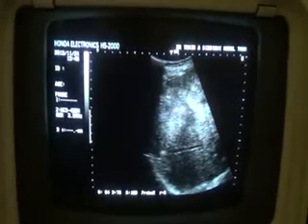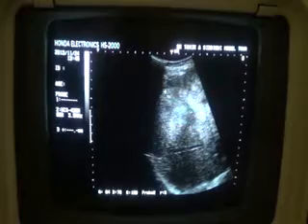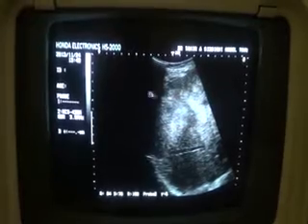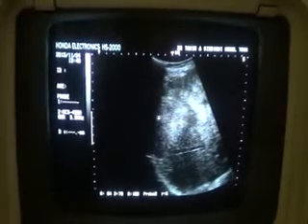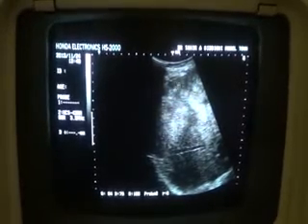This is the right hepatic vein. Thank you.